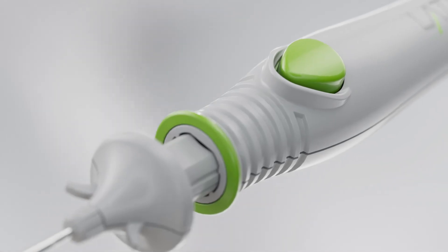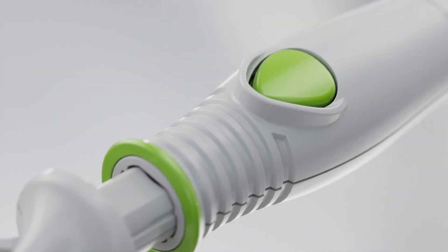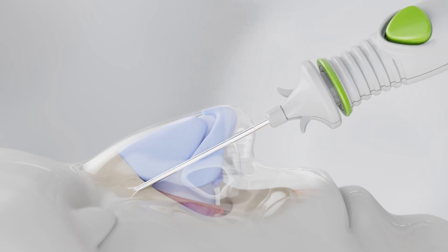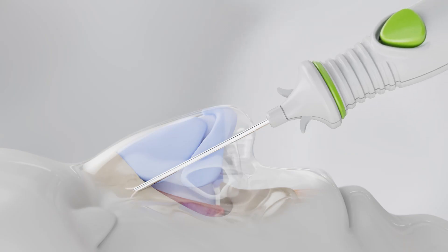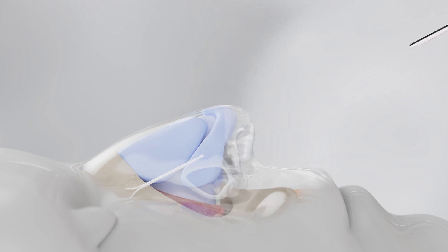Stabilize the trocar of the Latera device and, without applying pressure to the device, push the deploy button. Slowly advance only the handle of the device forward — this is how the implant is placed within the tissue. Slowly retract the Latera device in the same path of insertion. Check the pierce points to ensure the implant is not visible intranasally. Help your patients experience what it's like to breathe easier with Latera.